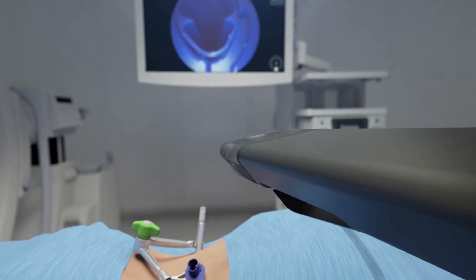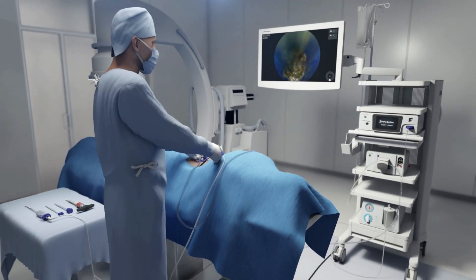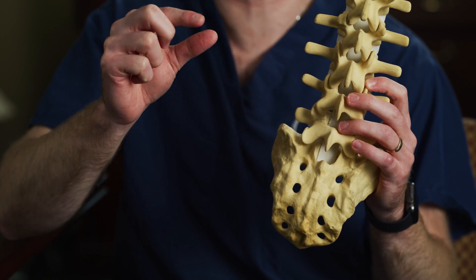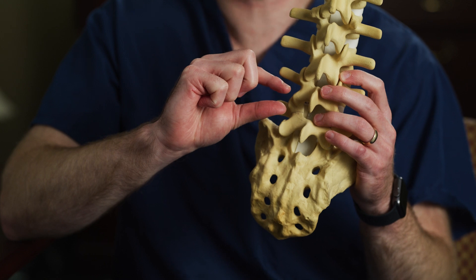In patients with instability where we deem a fusion necessary and there's no other non-surgical or surgical option, that's when this ultra-minimally invasive technique becomes an option. We make a small incision and place our tube right down to the joint of interest. We then place the camera through the tube, allowing us to see the nerves and things that might be under pressure. With microscopic tools, we remove the joint to access the disk space — the shock-absorbing cushion between vertebrae. When that becomes diseased through wear and tear, arthritis, or degeneration, it causes pressure on the nerves exiting down the legs, resulting in that leg pain.